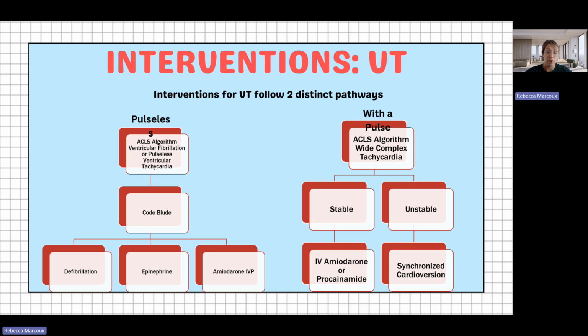If the patient is unstable or has signs of impaired cardiac output, generally we would move to a synchronized cardioversion. The key here is that it is synchronized. We do not defibrillate patients that are alive. We have to make sure we are in sync mode to make sure we're syncing with the R waves. The other thing to remember when we're doing synchronized cardioversion is these patients need pain management and usually conscious sedation because we're applying electricity to their bodies. It can really, really hurt.